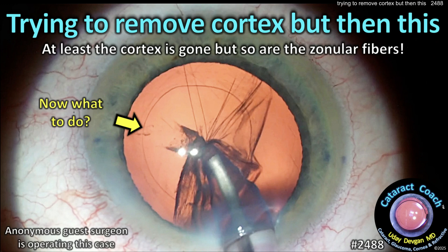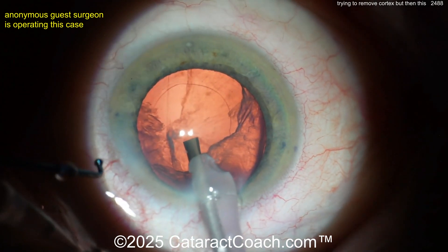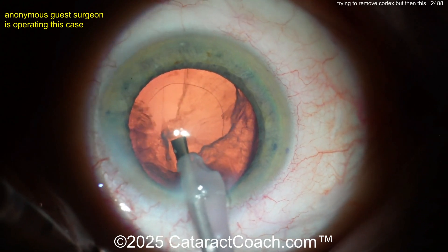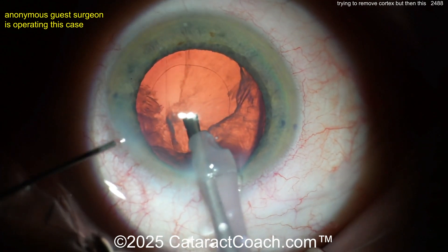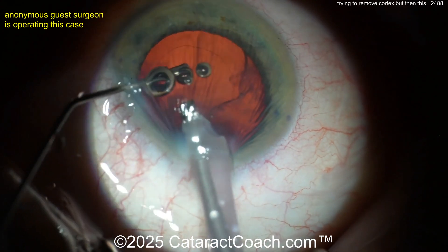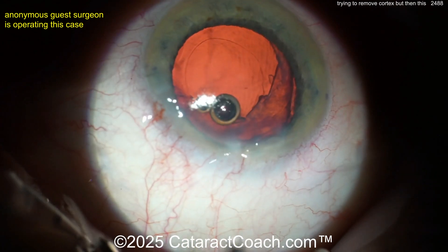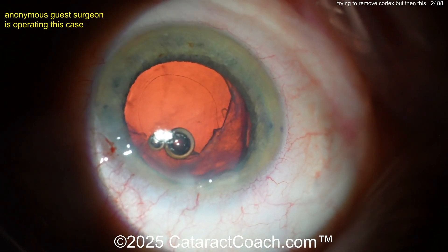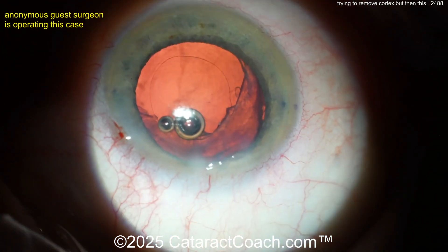From cataractcoach.com: trying to remove the cortex, but then this happens — at least the cortex is gone, but so are the zonular support fibers. Now what are you going to do? Watch this case. It looks okay now, but notice the right side of the screen — there's a little bit of a lens equator showing, certainly some zonulopathy. Look how the rhexis has shifted a little bit to the left. Going in with viscoelastic — don't let the eye collapse. Smart move. Injecting the viscoelastic, keeping the probe in the eye. Now let's take the probe out and evaluate. There's certainly some cortex there, but you have to do something to stabilize the capsular bag.